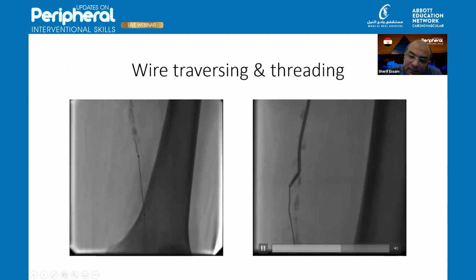Yes. We have some questions from our colleague, Dr. Tamer Fikri, a vascular surgeon, our friend. He asked about having two access sites, from the right brachial and from the femoral. Left brachial or right brachial? Just one brachial and one femoral, he said. You prefer something like it?